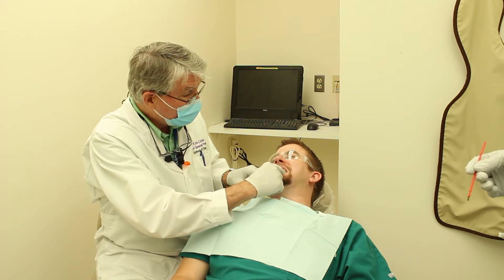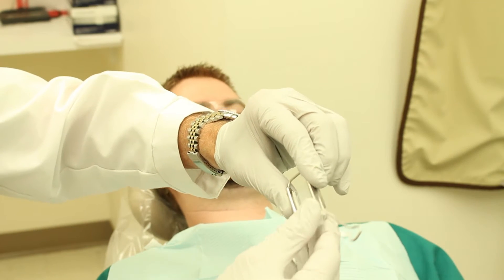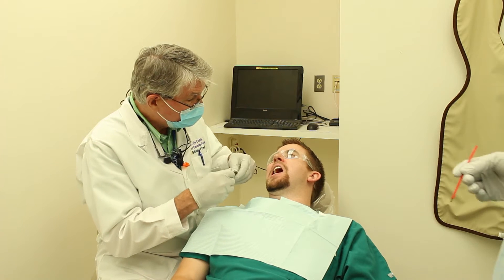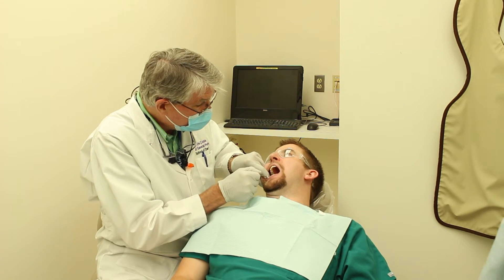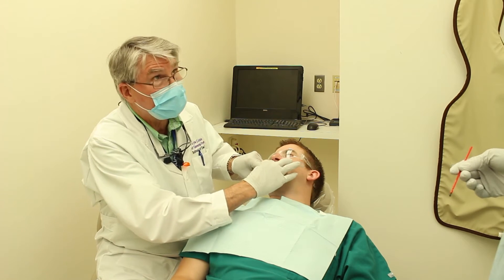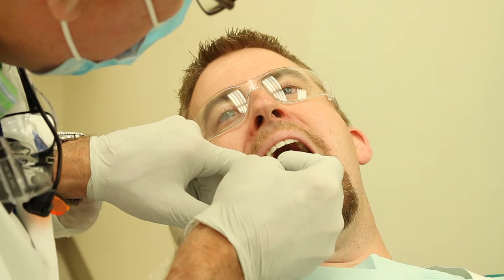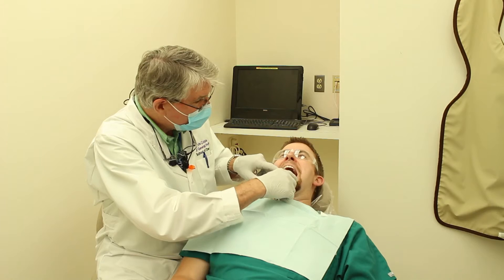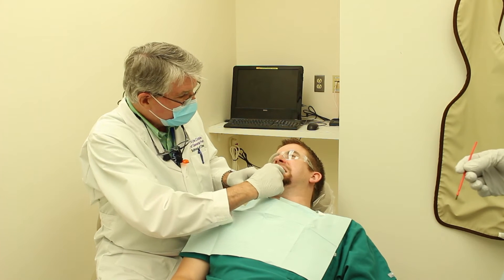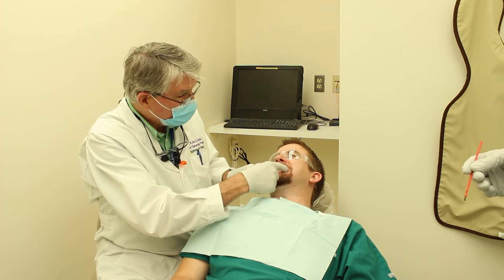Once you're ready for the impression of your tooth, you try in the tray after fitting in the mesh. Have the patient close, and be sure they're closing properly in normal occlusion. Check the contralateral side and find a reference point. The tray should fit passively — you should be able to move it freely. Check your reference point on the contralateral side, and once you've done that, you're ready.